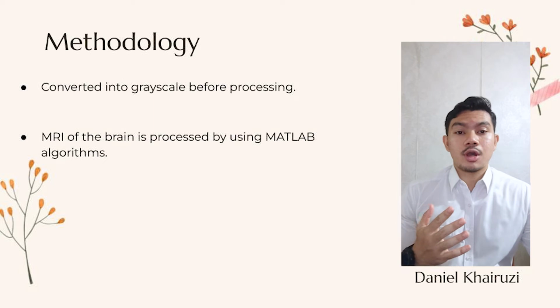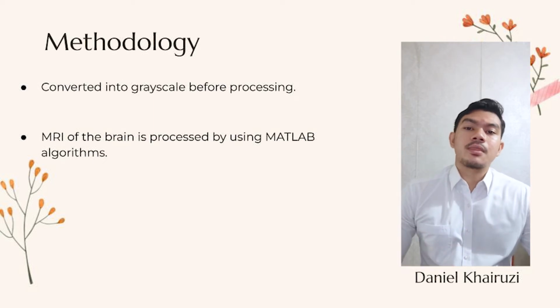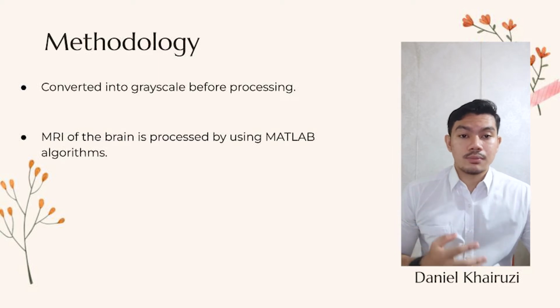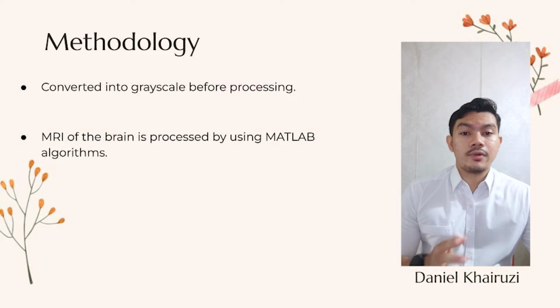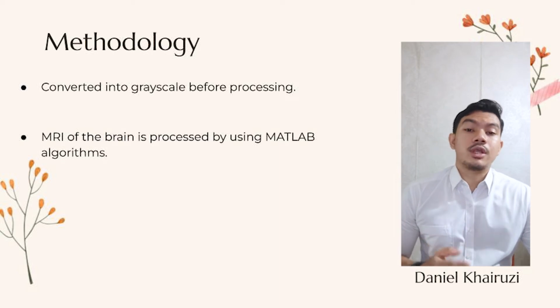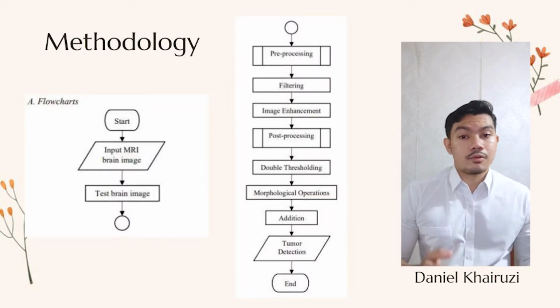So I will present the methodology for our project. The proposed methodology is applied to a real dataset including brain MRI images, which were converted into grayscale before further processing. For brain tumor segmentation, an MRI of the brain is processed using a MATLAB algorithm. So this is a flow chart.